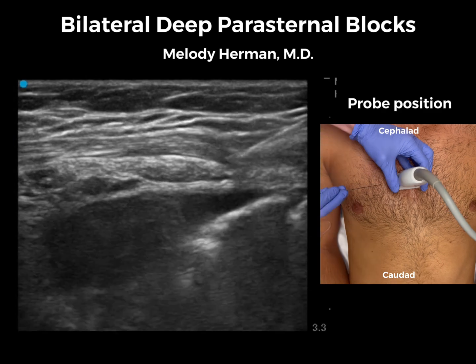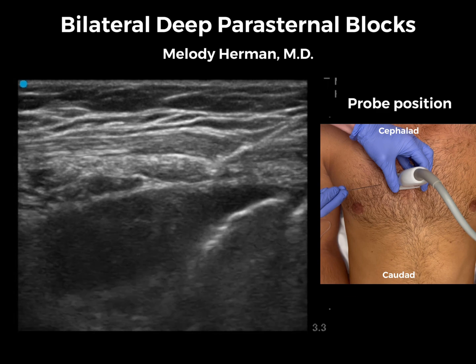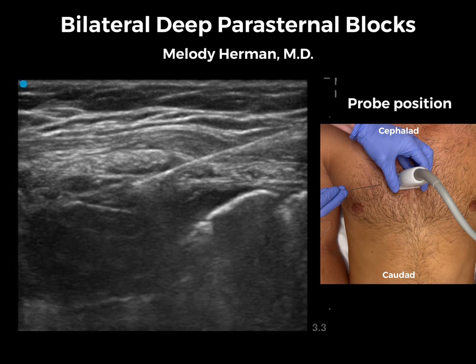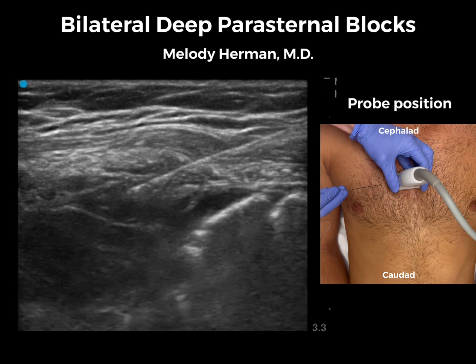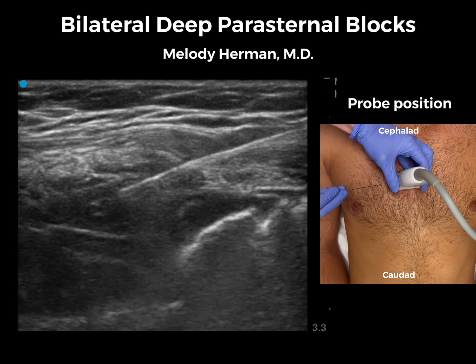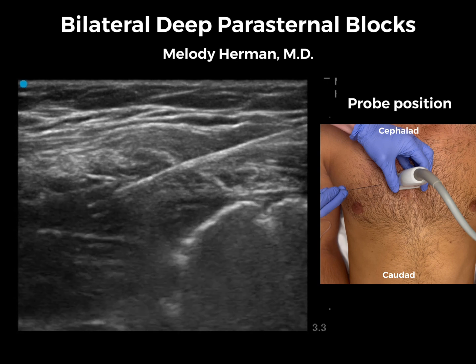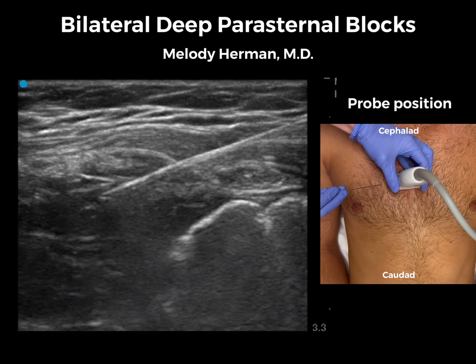We'll advance lateral to medial using an in-plane approach, and once we are under the internal intercostal muscle we will give our test injection with saline. This injection looks smooth — it's not shreddy or mottled, which would be signs that we are intramuscular and not in the fascial plane. We don't see the transversus thoracic muscle, which is usually the case, and the lung is not moving that much with our injection, also expected due to scarring from the previous excision.